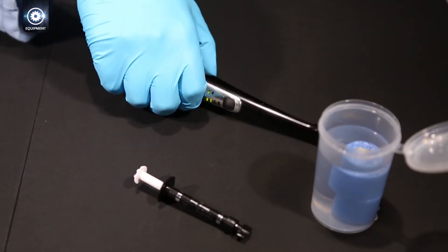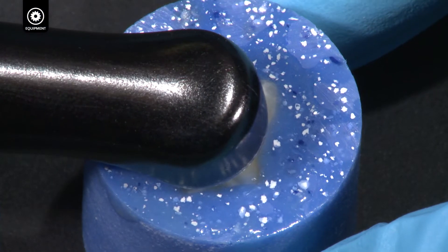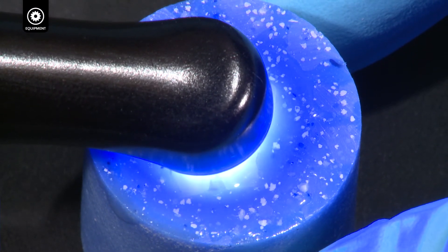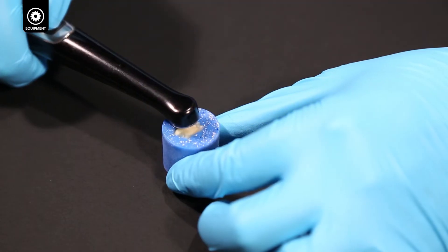Light cure for 10 seconds with BALO in standard power mode, as close as possible without touching the surface. If using a curing light other than BALO, follow the manufacturer's instructions.